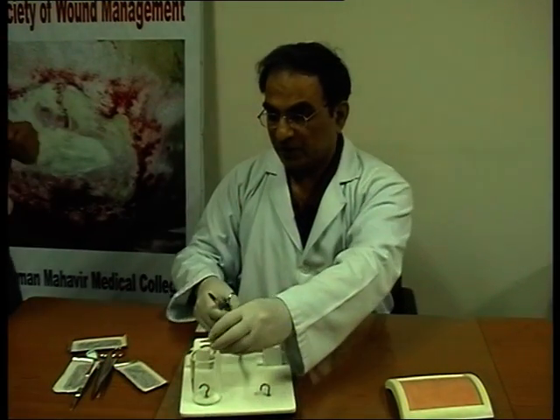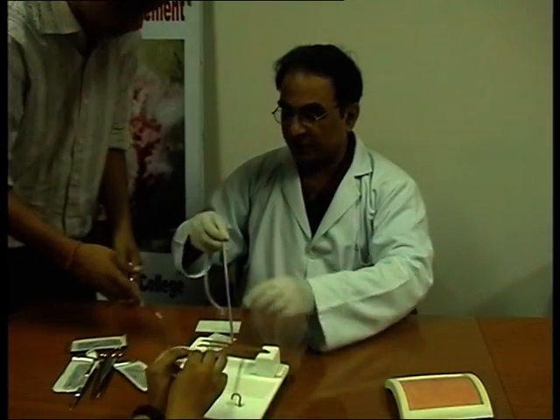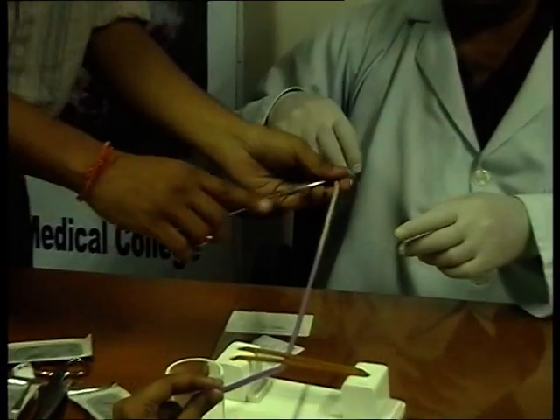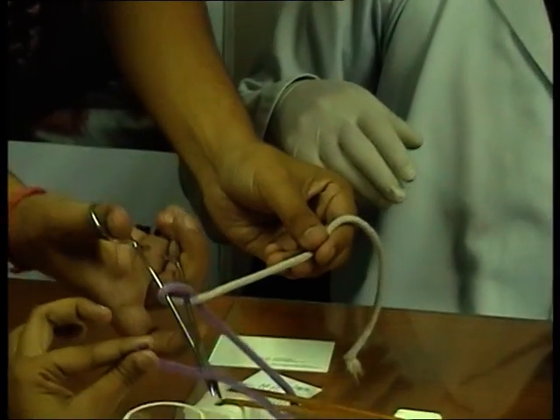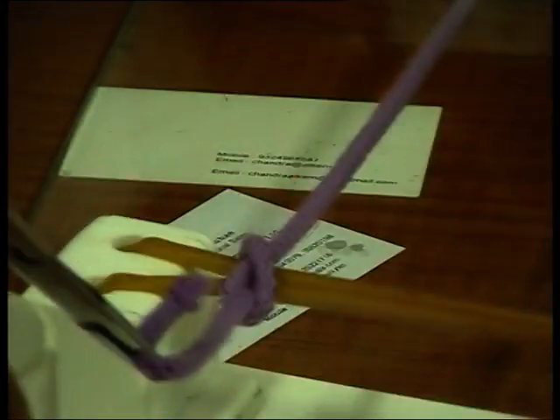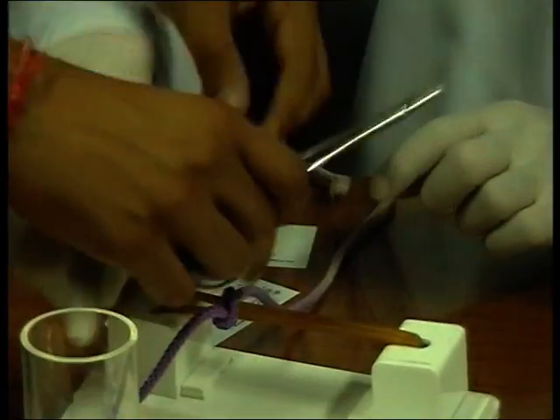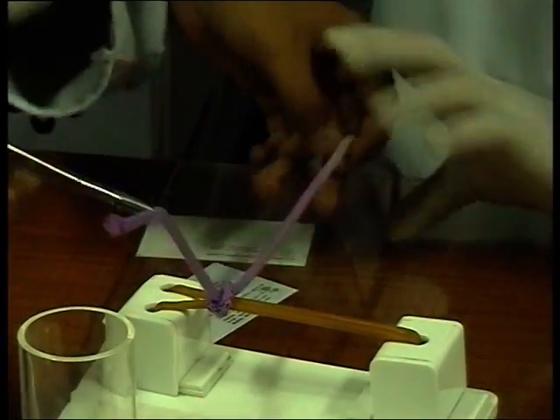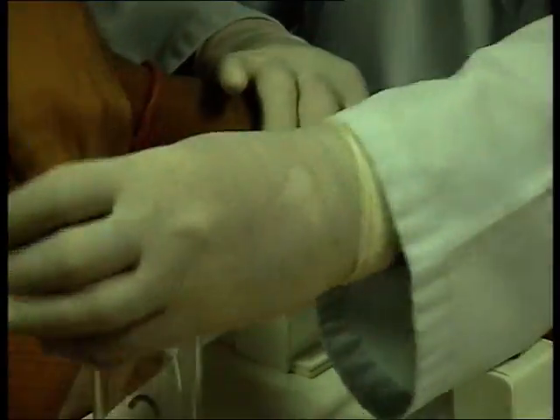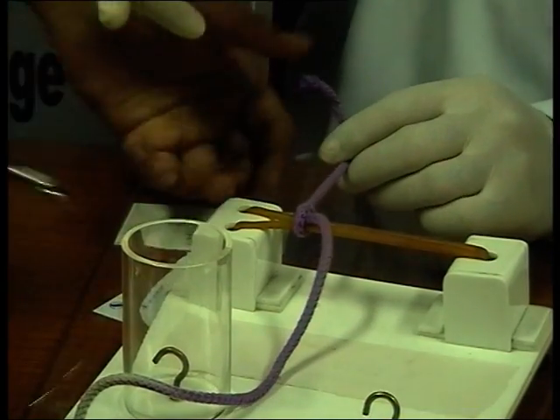Okay. Now, hold this. Now he's going to hold this with you. This you hold. You hold it. Yes. Hold the tip. Try to hold the tip. See, what's the mistake? He's not crossed. So what happens to the knot? See, it looks ugly. You cross. Hold it. No. Hold the thread. Cross here, like this. Now, clear? That's what I mean by it. Then go there. Then come back here. Then put the next one. Take that here.